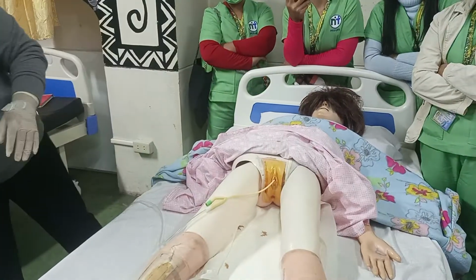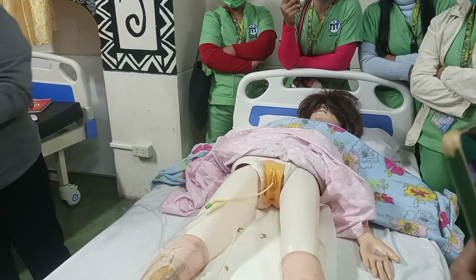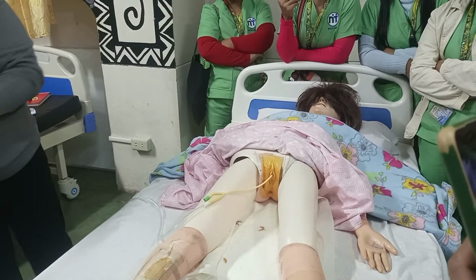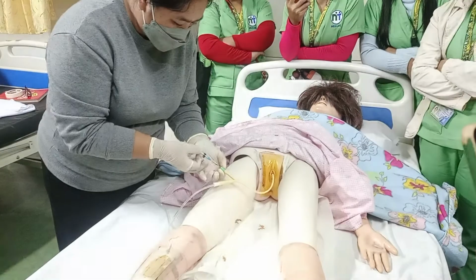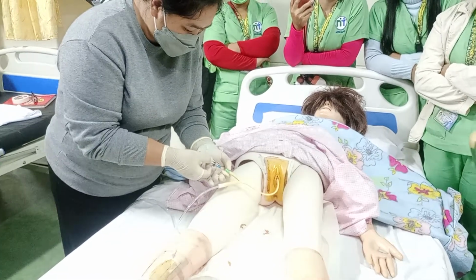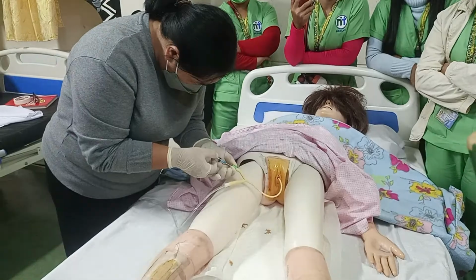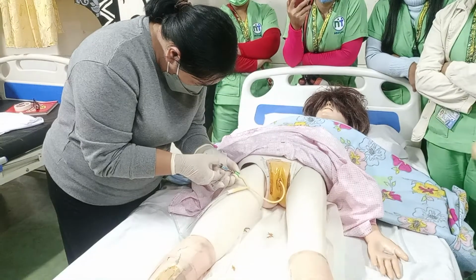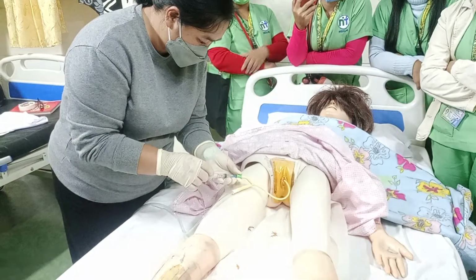Now, get your extra syringe. Kalimutan kong banggitin kanina. Okay? Hindi na siya sterile, kaya pwedeng ikaw na lang ang magtanggal. And then, you're going to remove the water na pinang-angkor nyo kanina. Okay? Again, pakiramdaman pag nag-i-insert ha. Ayan. Ayaw na niya matusok. Okay? Then, aspirate.